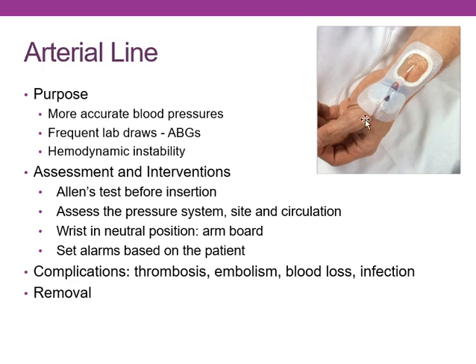I don't have a pulse, can't assess distal pulse. Now, if I have a brachial A line, I can assess a distal pulse, which is radial. If I have a femoral, I'm going to do distal pulses, which is pedal, posterior tibial. If I have a radial, I'm assessing perfusion here. So, you've learned a bunch of P's about perfusion. There's 3 I like. I like color, temp, and cap refill. Plus, when I do cap refill, I'm doing temp at the same time, and I'm looking at it, so I can do all those all at the same time.